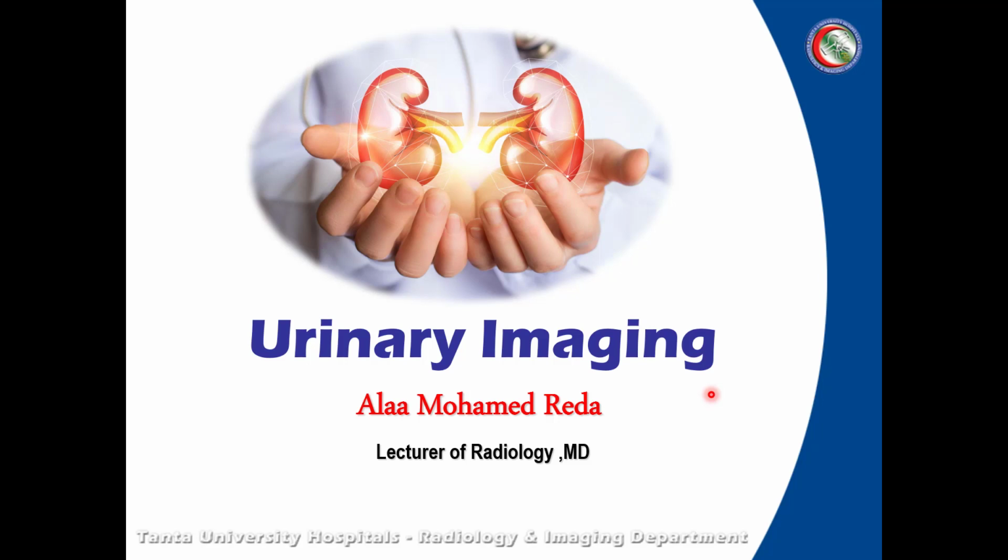Hi everybody, welcome to our radiology course for undergraduate. I am Alaa Muhammad Reda, lecturer of radio diagnosis. Today we will talk about basics for urinary imaging.